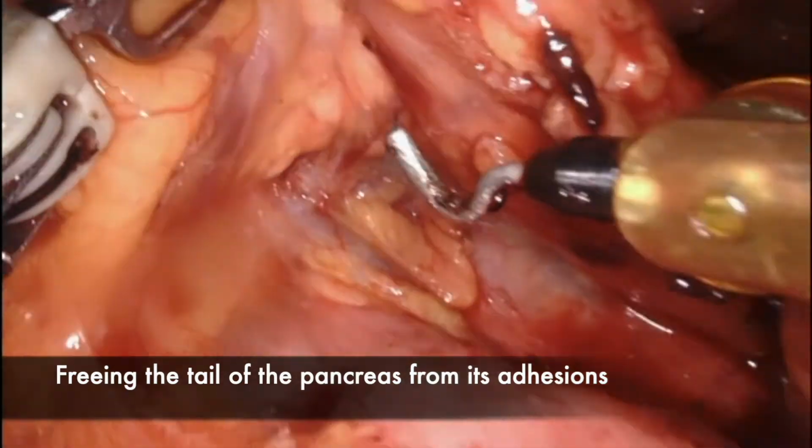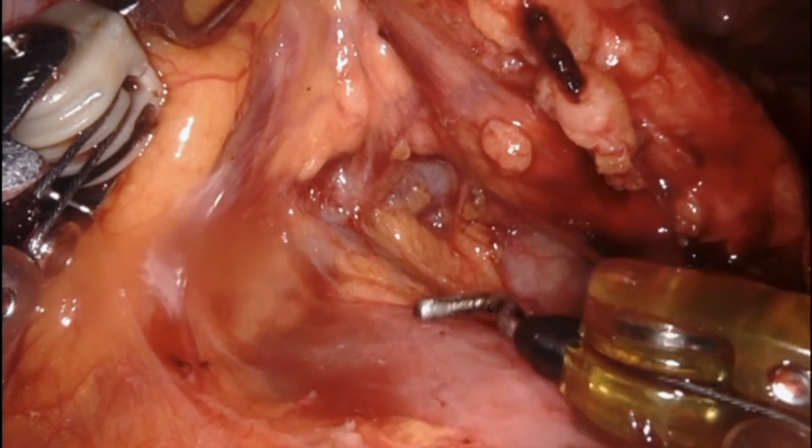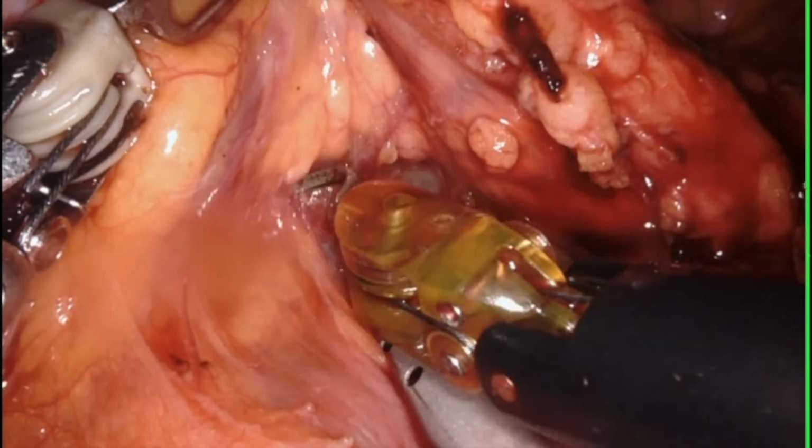For distal pancreatectomy, the inferior part of the pancreas is freed from its adhesions and the splenic vein and artery are identified.